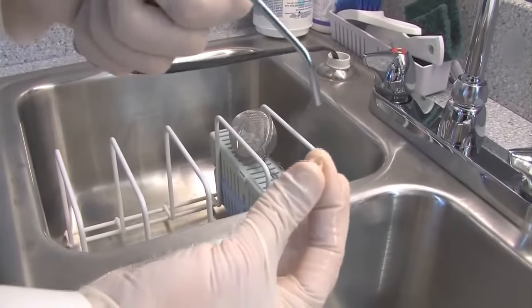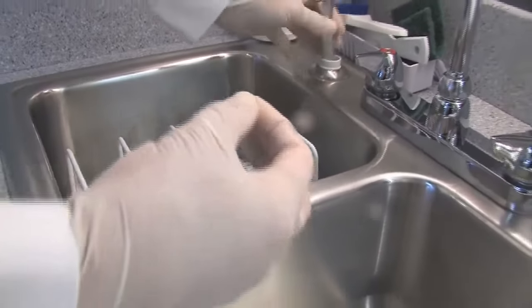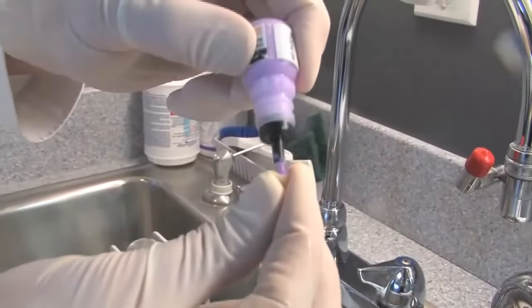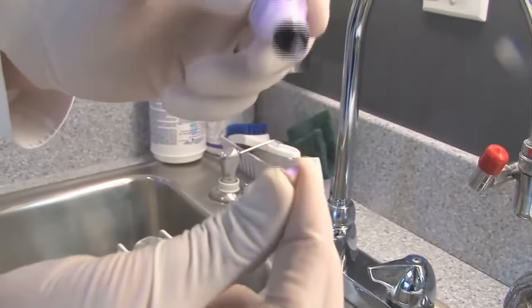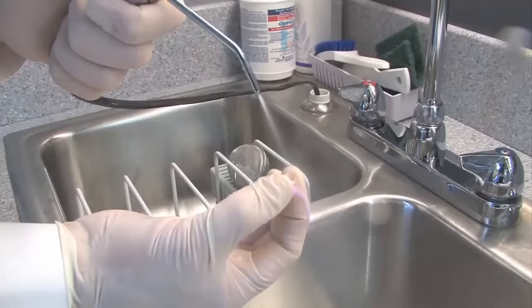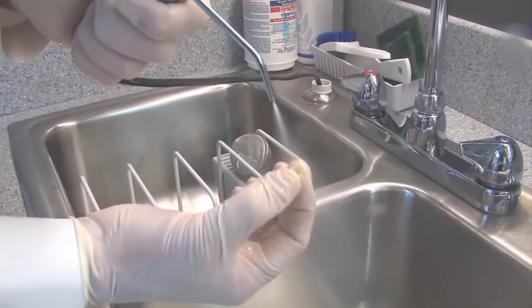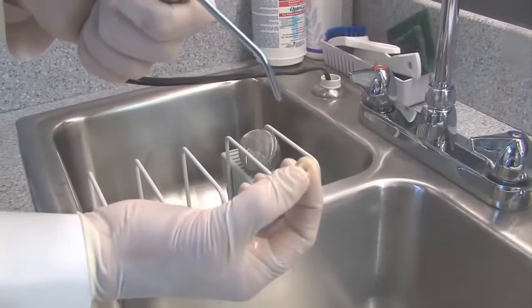After we take the crown and try it in, and the patient looks at it and gets their approval — this happens to be a solid zirconia crown — because of the possibility of contamination from the phosphate groups in the saliva, we're going to use a zirconia oxide solution and put that on the inside of this crown for 20 seconds. And then we're going to rinse that out.